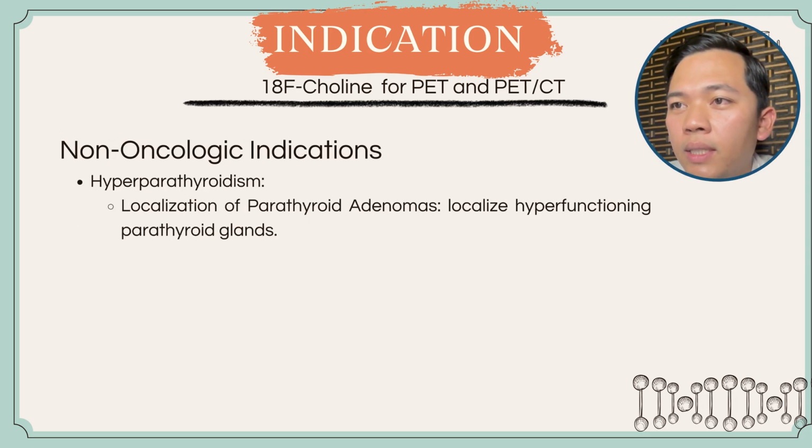Okay, now for the indications of non-oncologic use: hyperparathyroidism. The localization of parathyroid adenoma can be used in patients with primary or secondary hyperparathyroidism to localize the hyperfunctioning parathyroid gland, especially when other imaging is inconclusive.